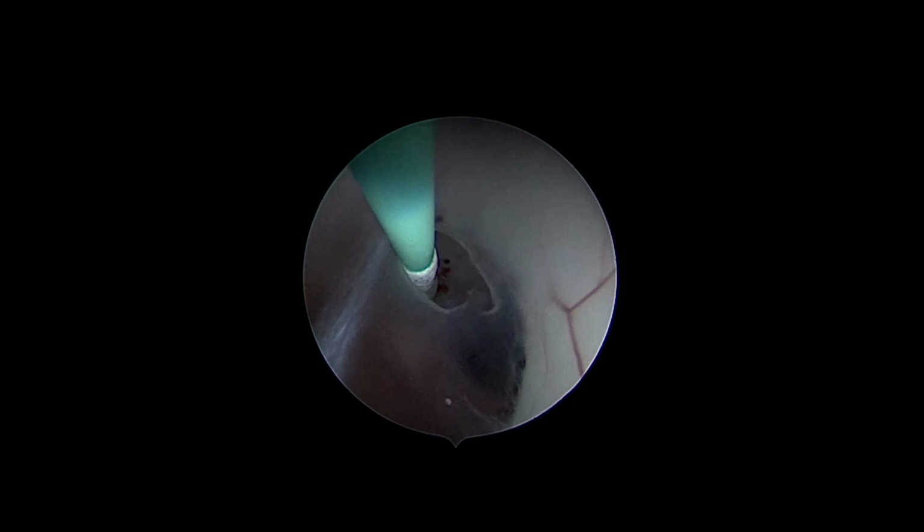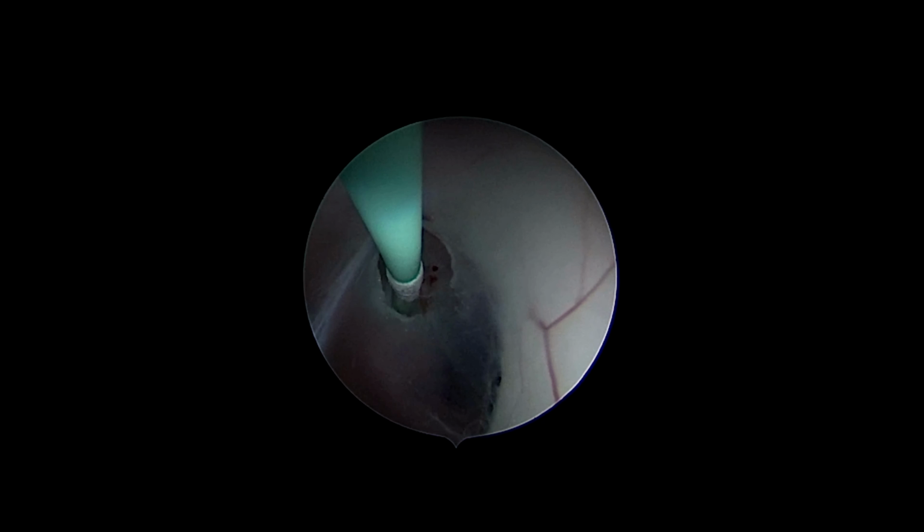One can see there are two layers on the floor. So we must penetrate both layers.